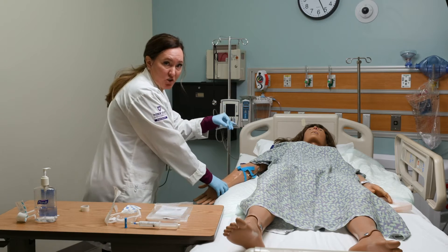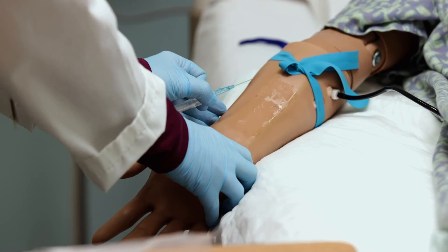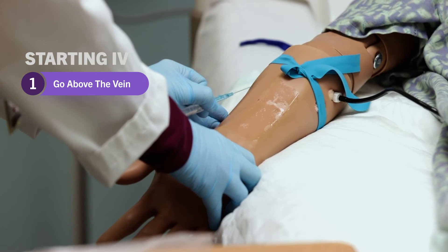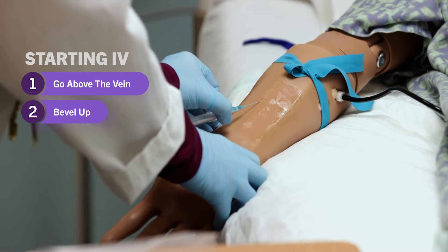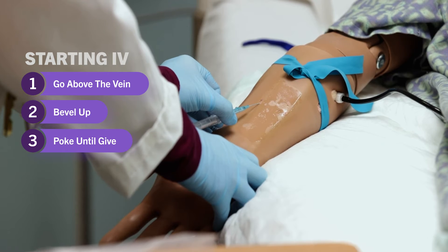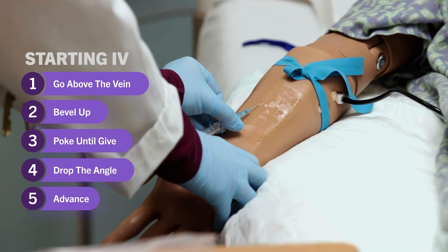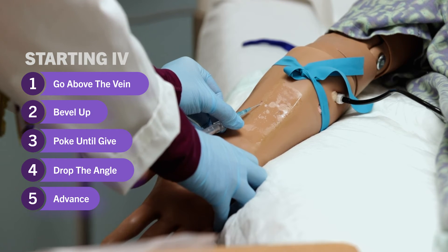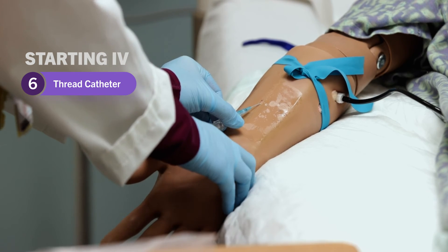I'm left-handed so I'll try to get at a good angle for you. I use these three fingers to stabilize my hand. Go right above the vein at an angle appropriate to the depth of the vein, bevel up, and poke just a little bit until you feel a give — you feel the needle enter the vein and you'll see a flashback. Then drop the angle a little bit more so you don't go all the way through the vein, advance just a little bit so that you get the entire catheter inside the vein, then thread the catheter forward.